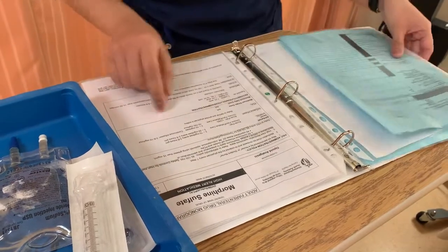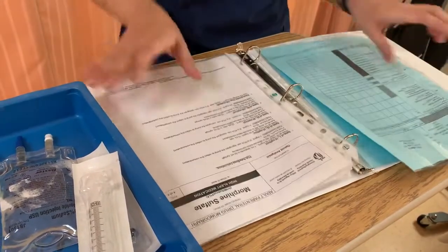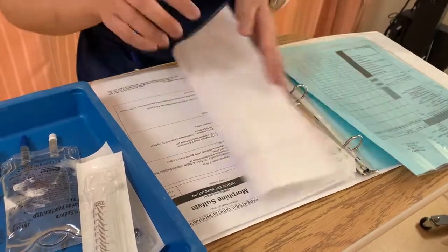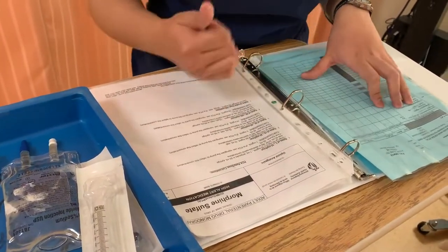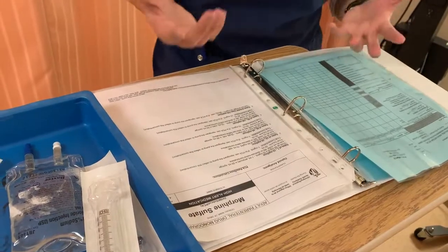And the safe dose for the PCA would be in the physician's orders, which we already checked is the usual 1 to 3 milligrams as well. So we are in the safe range.